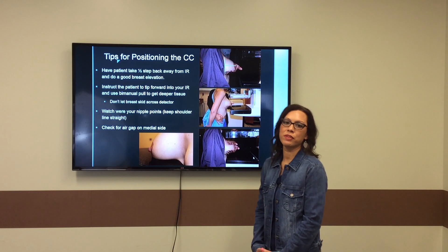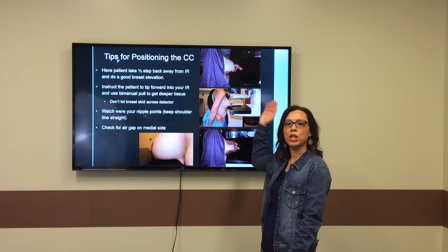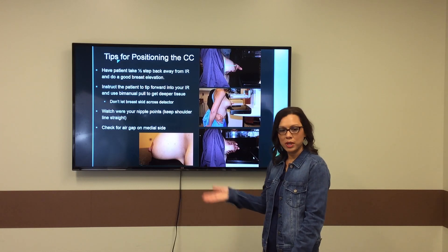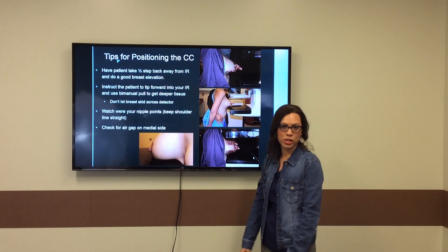One of the first things I feel is very important is that you not let your patient get too close to the machine so that you can do a good breast elevation. You want to lift the breast until your posterior nipple line is perpendicular to your chest wall.